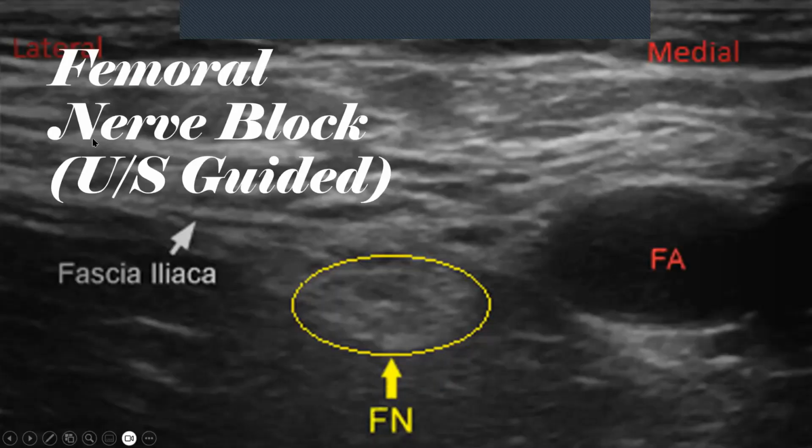So a femoral nerve block generally is done under the guidance of ultrasound. What happens is that you go to where you would try and take your femoral blood gas, for example. So there's your femoral artery and your femoral vein, quite large over there, which would be medial. And then this would be the middle. And then this is what your femoral nerve looks like.